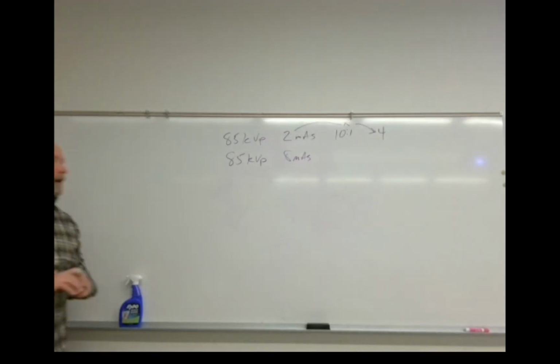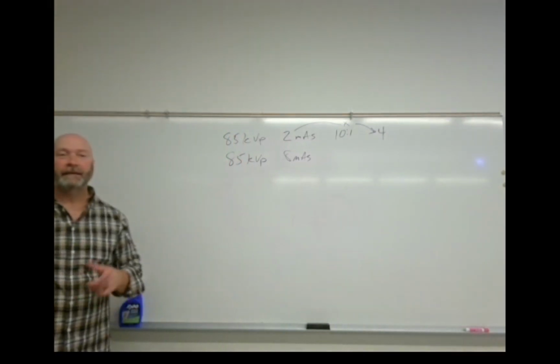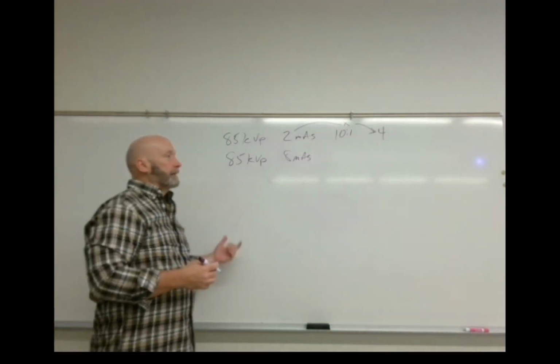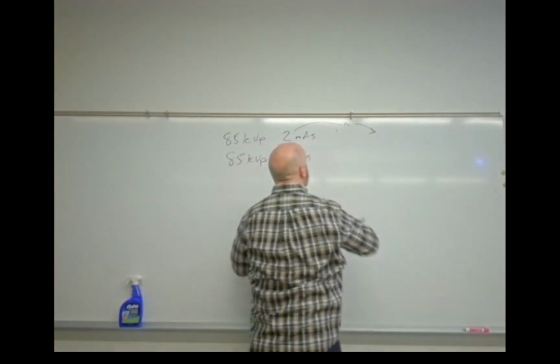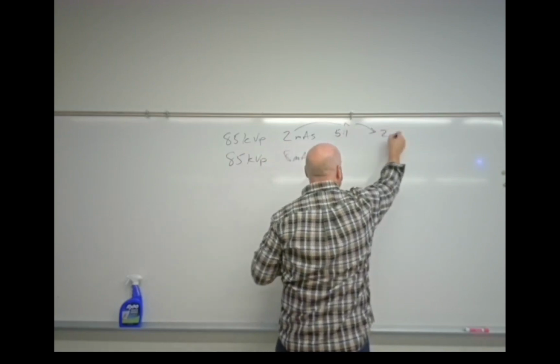Okay. So also though, you may, and I don't think there are any on this test, but just to kind of prep you for the fall semester, there will be these. And that is, let's change this up just a little bit. And let's say that was a 5-to-1 with a Bucky factor of 2.